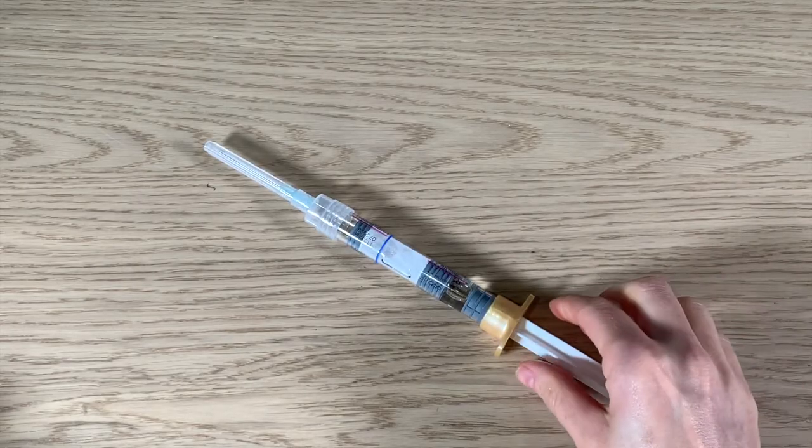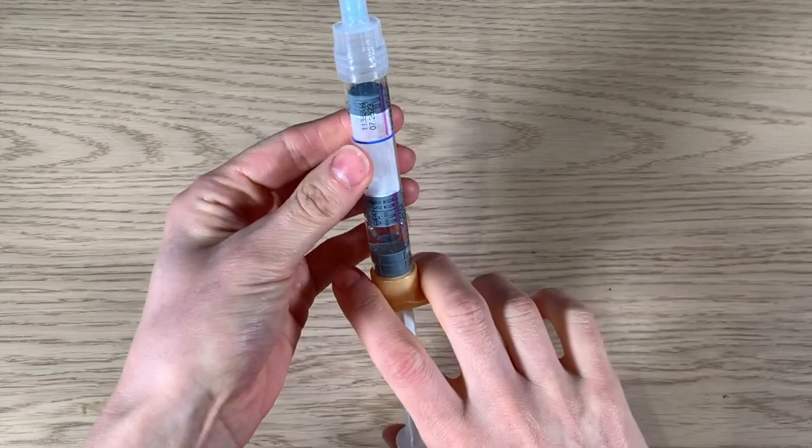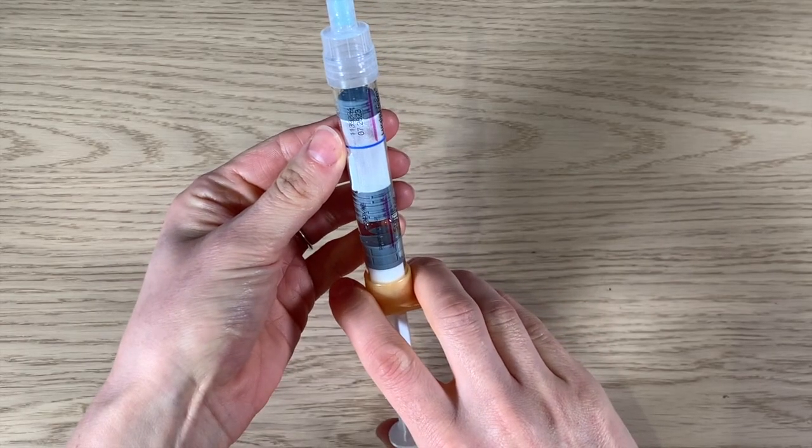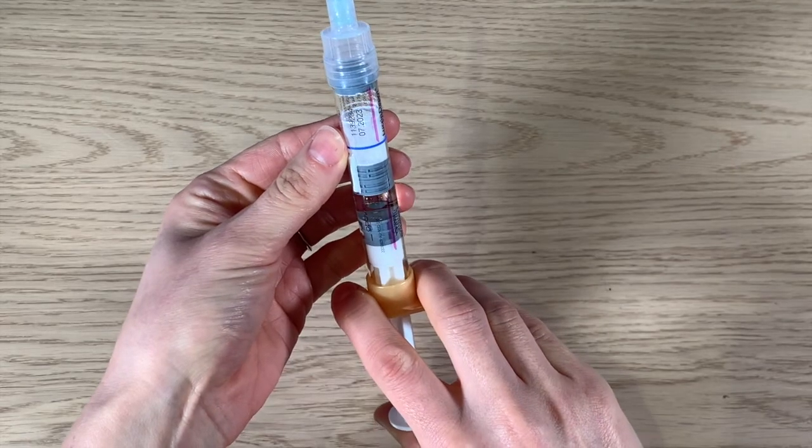The next step is to press the plunger to mix the diluent with the powder. You can see this happening as the plunger is pressed. Keep pressing the plunger until the upper rubber stopper meets the blue line on the syringe.